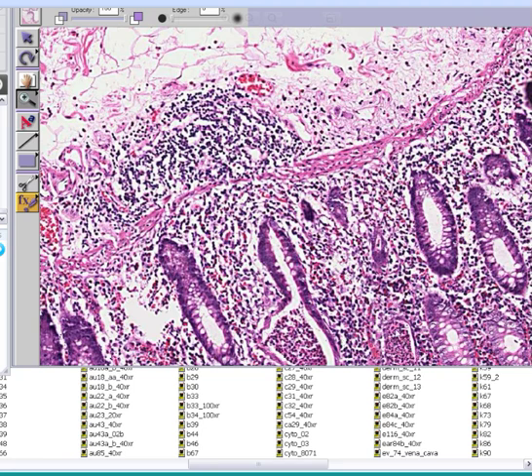You can see another one here where my pointer is, I think, and you can see a bigger one here in which you see not only an abscess, but you could see it's also causing attenuation of the epithelial cells of the crypt as well. And in addition, you just see more inflammatory cells throughout the mucosa and superficial submucosa as well.